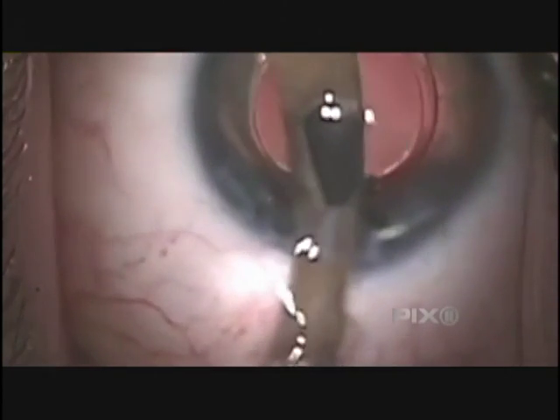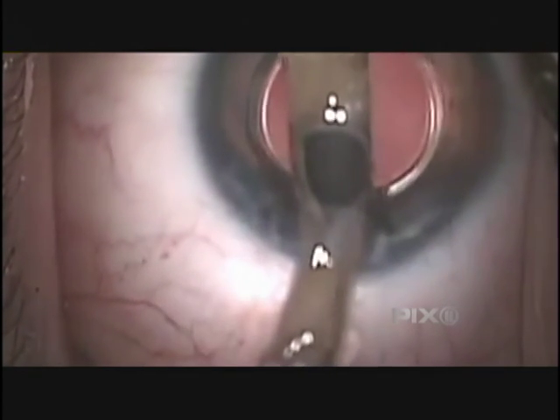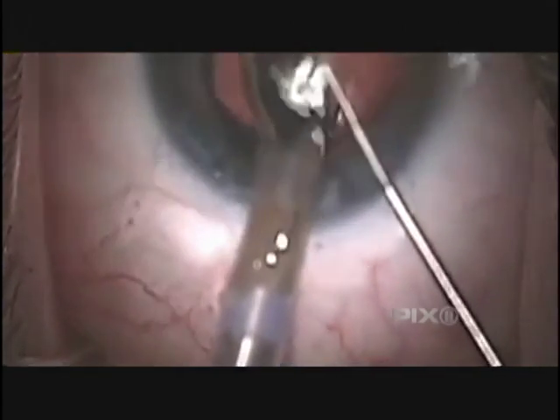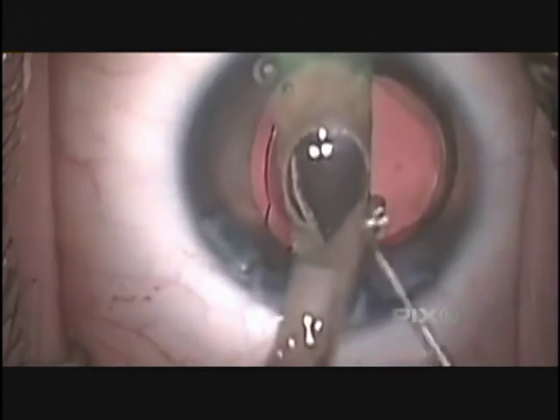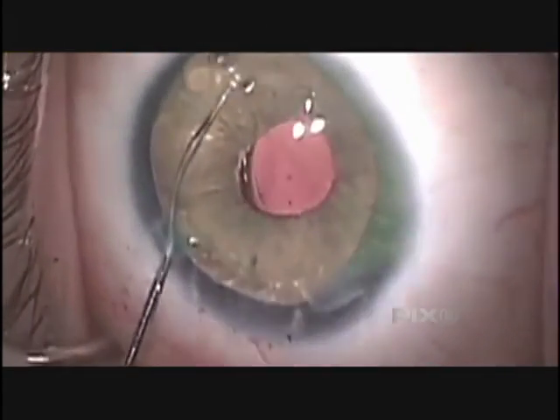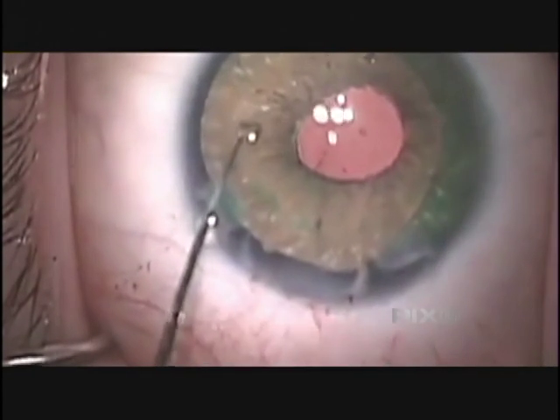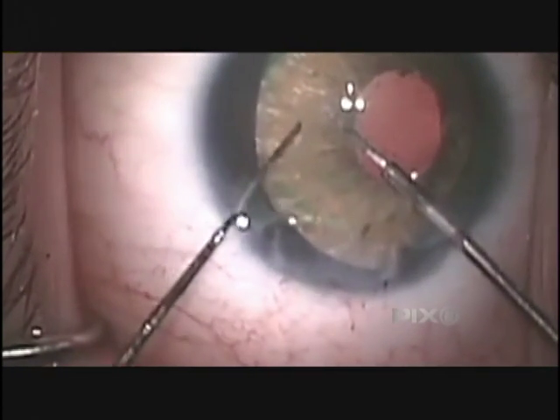Which is amazing. It kind of springs open. It springs open because it's silicone. Right. It's very soft. It's very gentle to the tissues. Now, this is a device that's made in Germany, and this is part of the FDA clinical trials that we're now undertaking to determine its safety and efficacy. But we've done these before the clinical trials as a compassionate use. In other words, the FDA has given us permission on an individual basis. So we have some experience with this. It's been very positive. And I think this is a safe device.